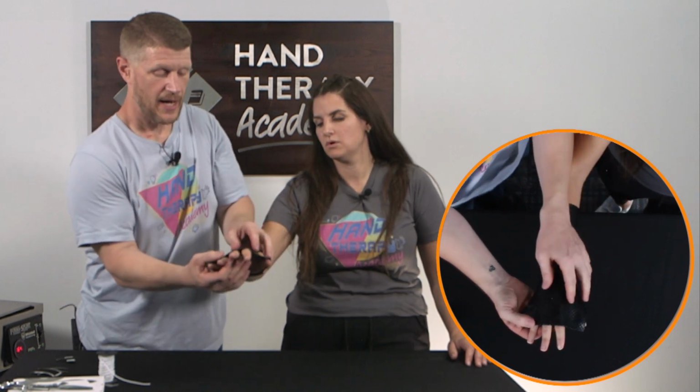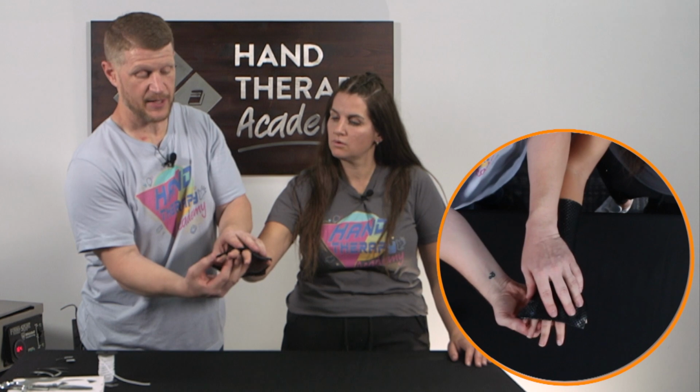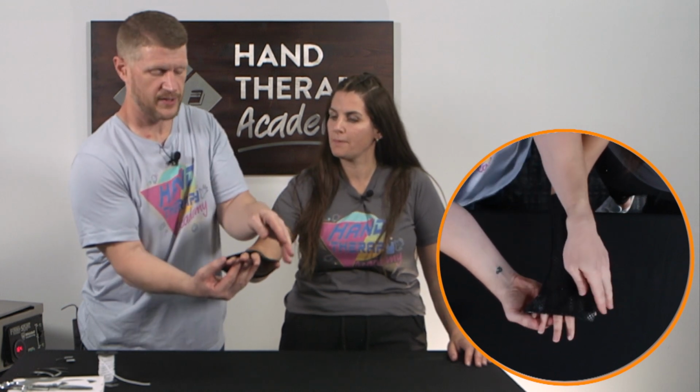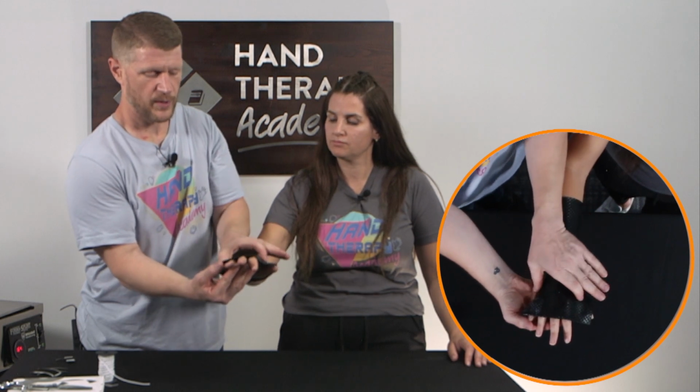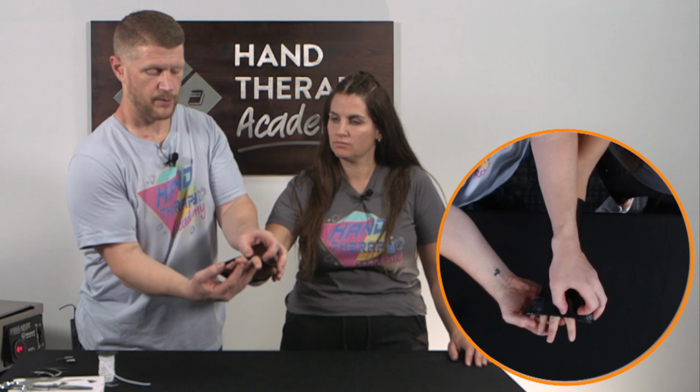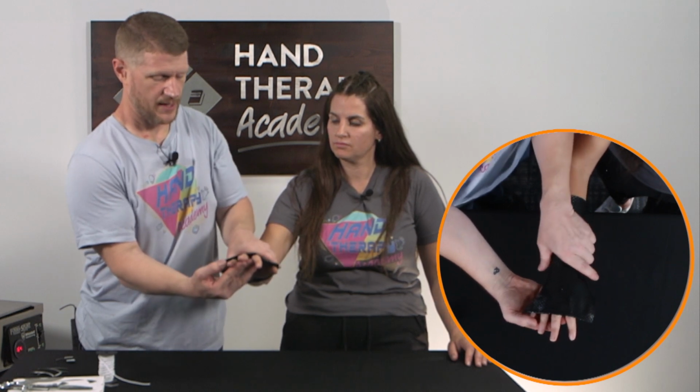While it's cooling, I just want to make sure I have some decent space to work through for each finger because we don't really grab things with fingers closed. We want a more neutral resting position there. And so that gives me some good width to that. Make sure I have some space in here as a border on the radial side of that index finger and just kind of wait for it to cool.